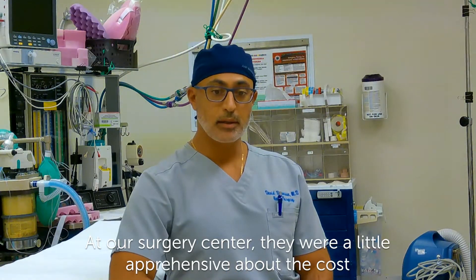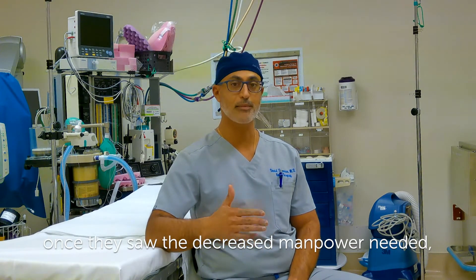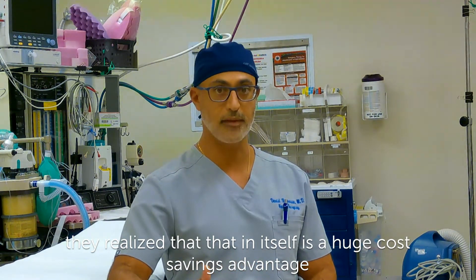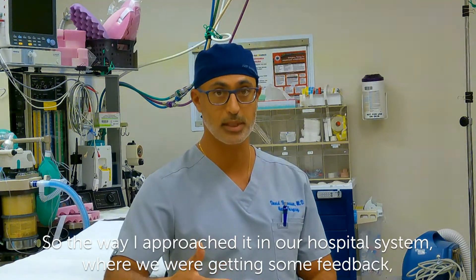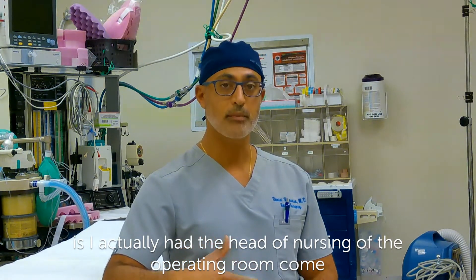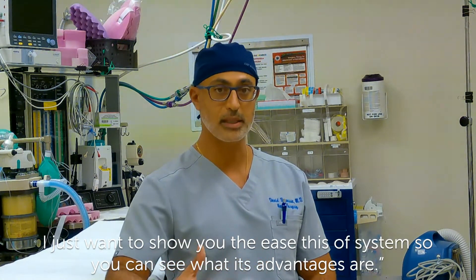At our surgery center, they were a little apprehensive about the cost. Once they saw the decreased OR time, once they saw the decreased manpower needed, they realized that in itself is a huge cost savings advantage. In the hospital, the way I approached it where we were getting some feedback is I actually had the head of nursing of the operating room come, along with the CEO, and I had them say, 'Hey guys, I just want to show you the ease of this system so you can see what its advantages are.'